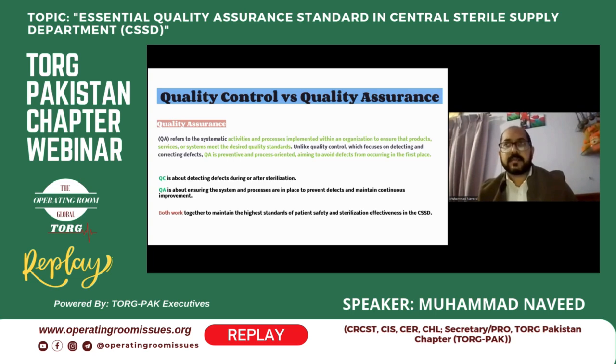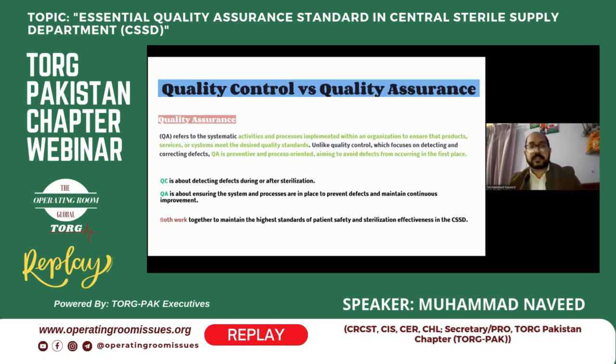In the perspective of CSSD, QC is about detecting defects during and after sterilization. Means when we are doing the process and after sterilization, if there are defects in our sterilization process and in our machines, this covers the QC, quality control.